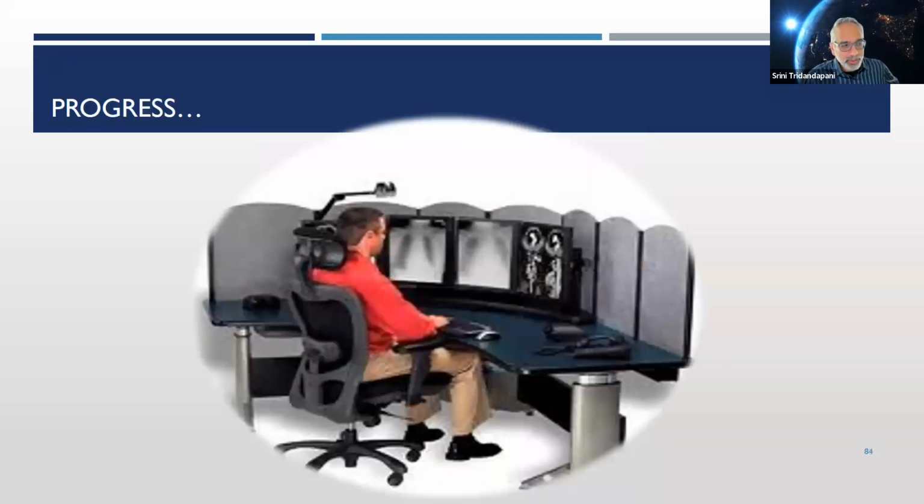And at some point we went digital. And digital was progress, because I could sit in one place and have images piped to me from all over the country, from many different hospitals. It made me more efficient. I didn't have to scroll up and down this panel to get to the right study. I could just do one click of a button and go to the patient's study that I wanted to see. So it made us very, very efficient.